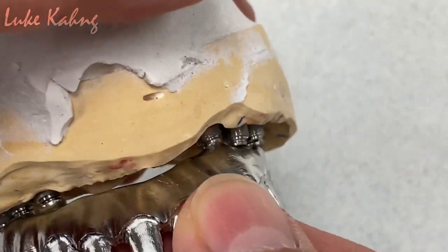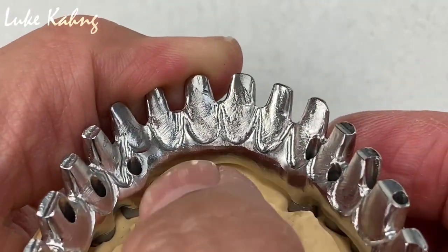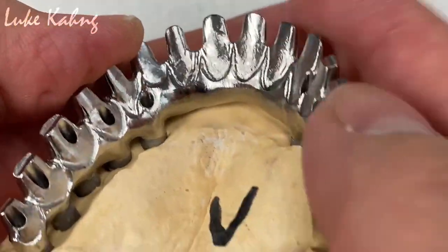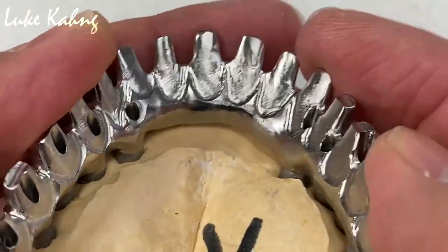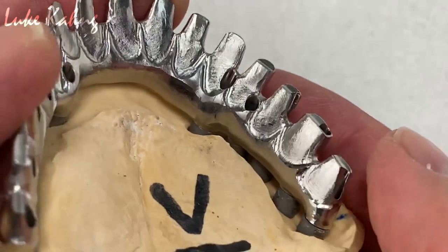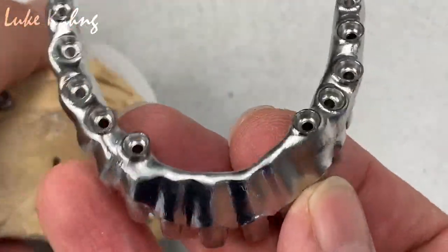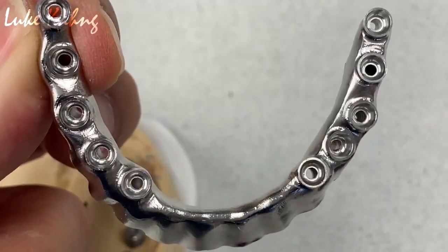Slight bit — it's great. And then we made great retention all the way to the bottom. Now it's coming up — 7-star case.